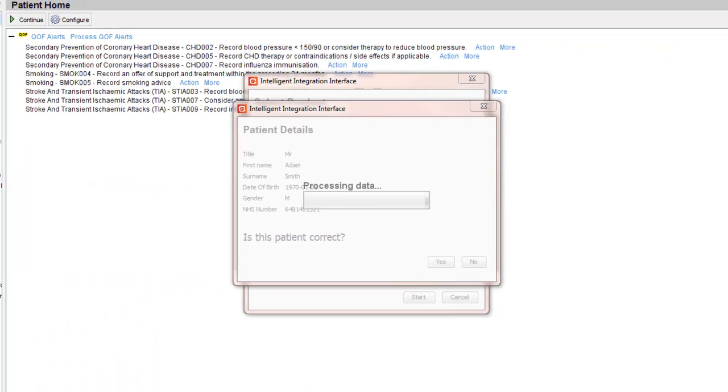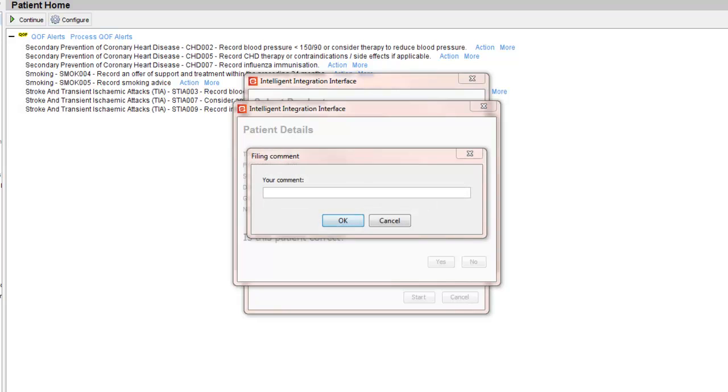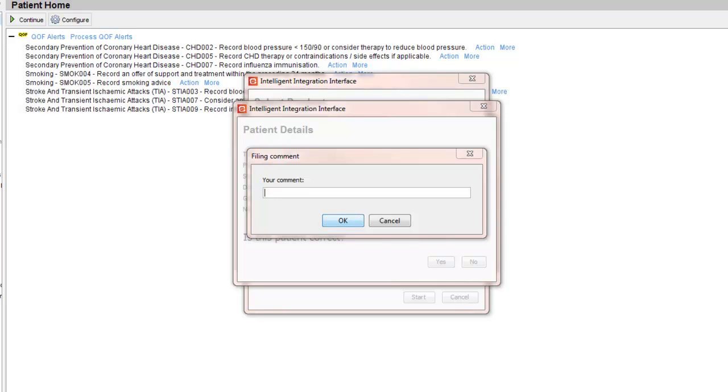This differs from many traditional trolley-based ECG machines, which often record for a period of time after the acquisition button is pressed. As part of the filing process, you have the opportunity to enter a comment to be filed alongside the ECG report in System 1. For example, you might want to note any patient-specific symptoms or who requested the ECG. We will just enter the word Training so that you can see where it appears.